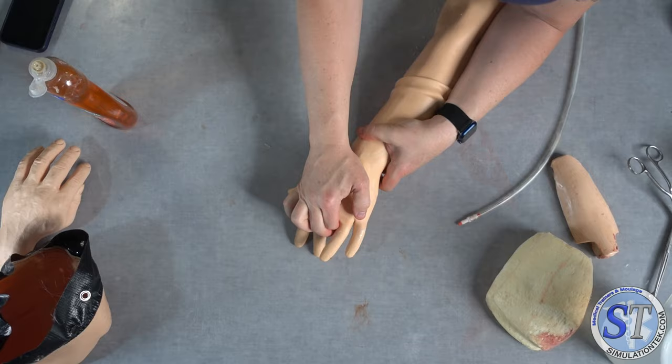So I've got my fingertips home, my thumb still needs to be adjusted. Still need to kind of slide this on just a little bit, like so. Then I need to peel this back down to put all the little inserts in.